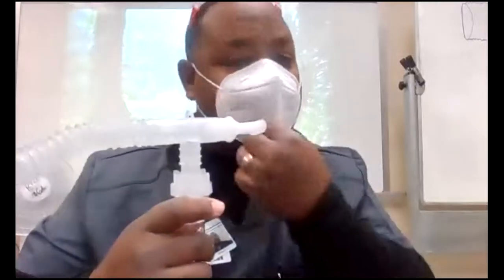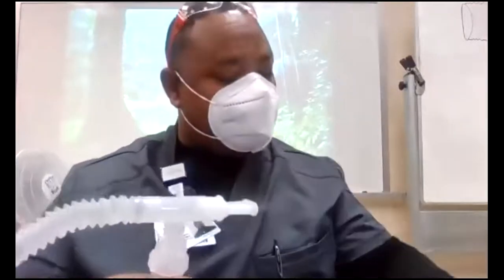Ventilatory pattern. Now, if I take this and suck it back like that, it's not going to go down in my parenchyma. It's going to all slam into the back of my throat, right? If you suck it in like that, you're not going to get it. If I'm doing it like that, I'm good, right?